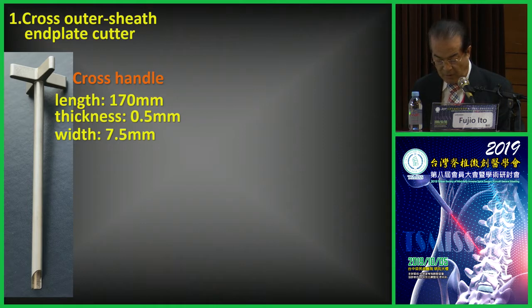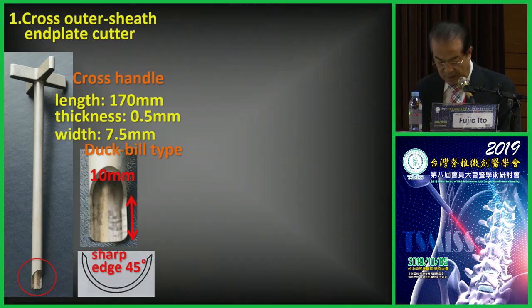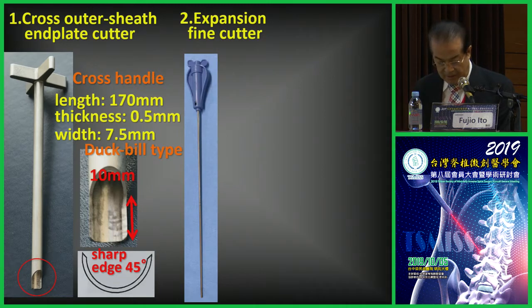It is important for bone fusion that the end plate should be scraped off to the extent that light bleeding is observed. The cross outer sheath end plate cutter is an evolution of the conventional 7.5 millimeter outer sheath. By rotating, the thin surface layer of the hard end plate can be scraped off. The tip is sharpened at both ends of a 10 millimeter duckbill. Each has a 45 degree blade. Another expansion fine cutter smoothes the remaining irregularity of the roughened end plate.